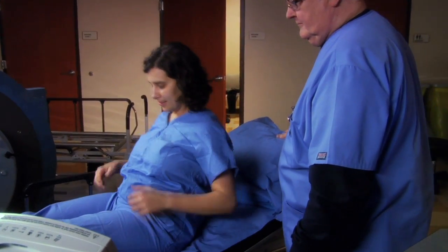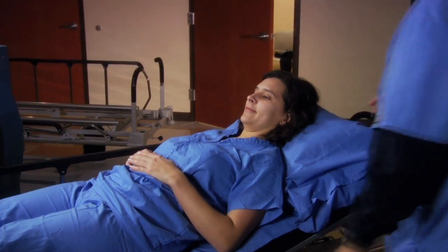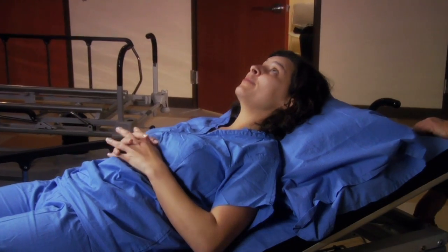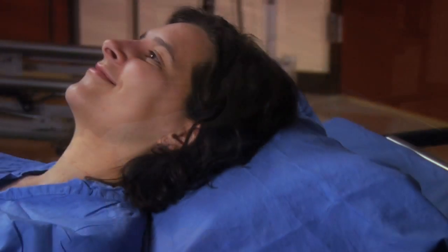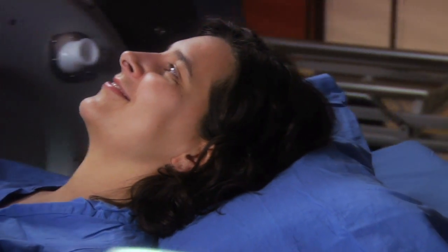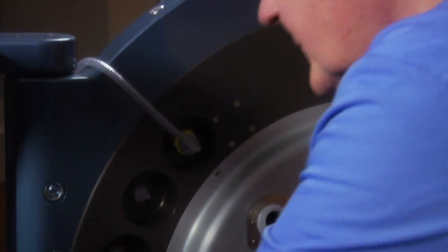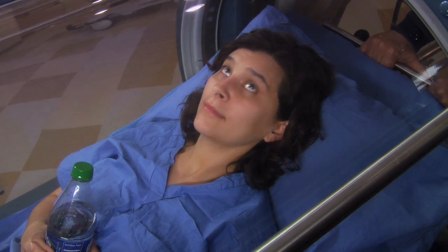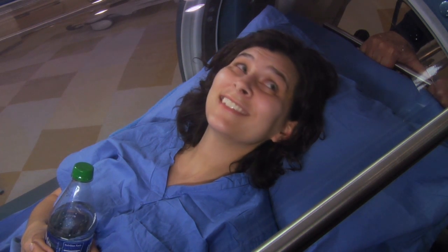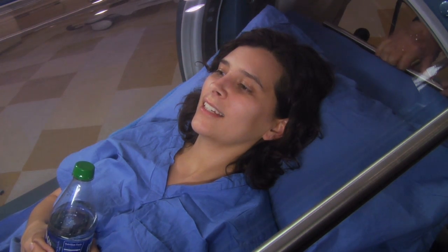Normally the treatments that the doctors prescribe would be 90 minutes at depth, and what that means, once the patient is pressurized, which means that they're at 14.7 pounds per square inch pressure, then we begin the 90-minute treatment. The time it takes to get from 0 to 14.7 is approximately 10 minutes, and for coming up, it's approximately the same. So in essence, you're in the chamber for 90 and another 20, so you're in there 110 minutes.